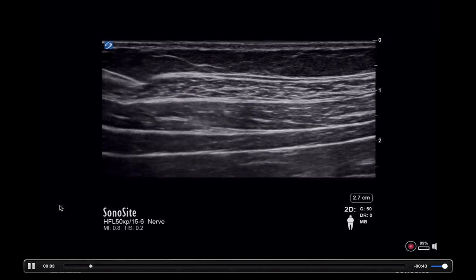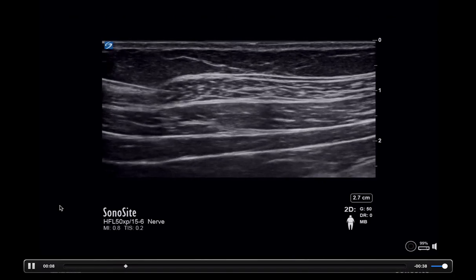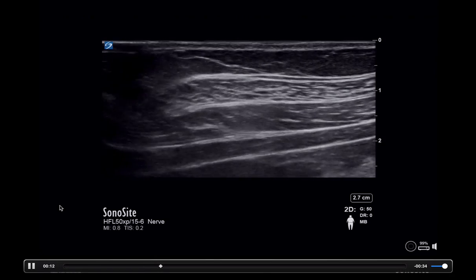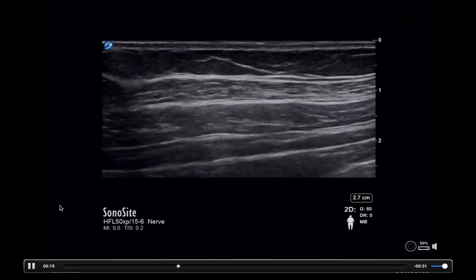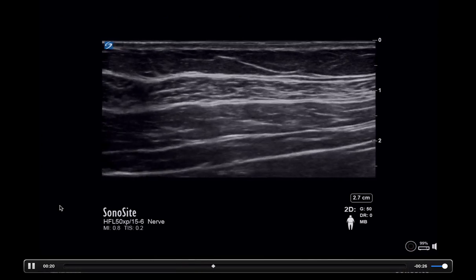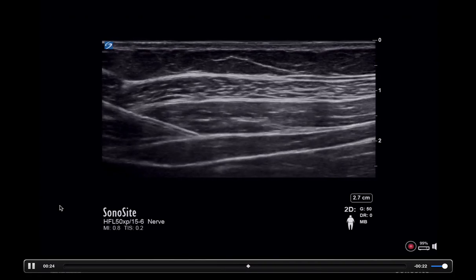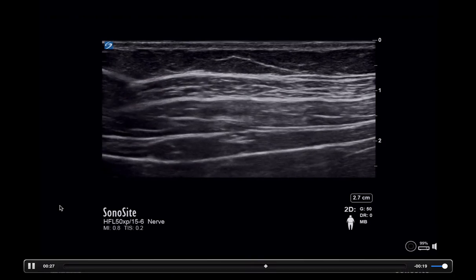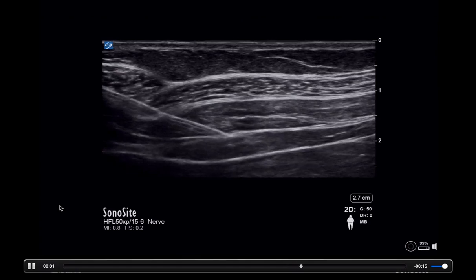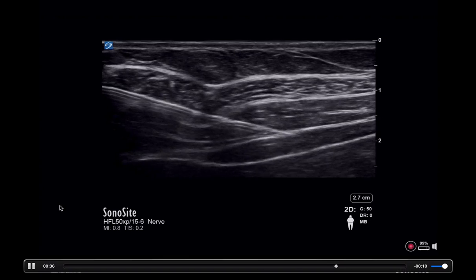And as you can see, they have the needle in view, which is a good view, and we're trying to get through the layers of muscle. And so they got through the first layer of the muscle, which is the external oblique, and now we are going through the internal oblique, and we're there, and now they are trying to puncture the area that is in between the internal oblique and the transversus abdominis, such that we can deposit the medication and infiltrate the nerves that we need to cover, so that we can have the coverage that we're looking for.